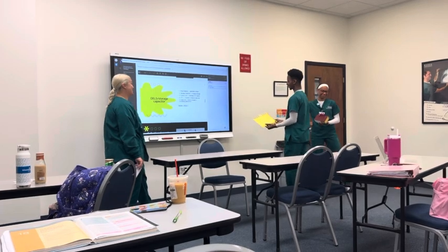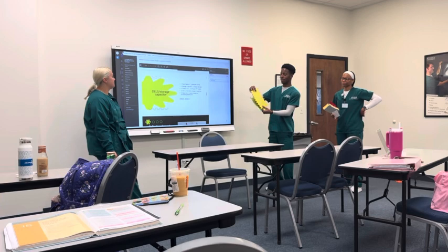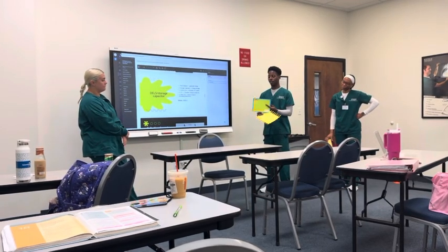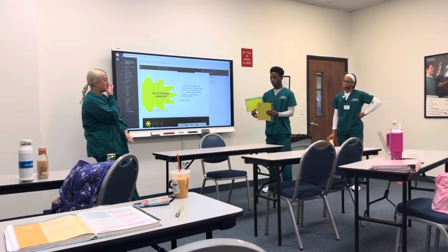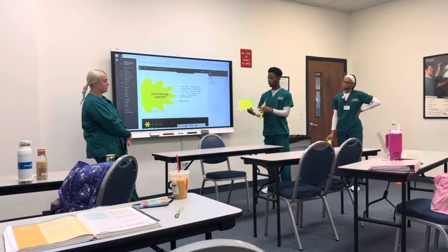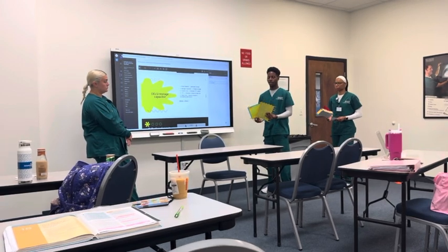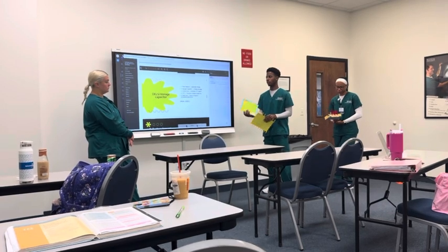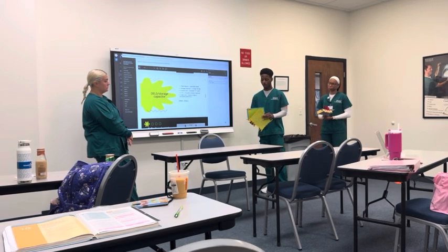This is the matrix array of a thin film transistor in direct digital radiography. This is a pixel element, also known as DEL. Each DEL has a photodetector, a thin film transistor, and a storage capacitor. The storage capacitor is made of amorphous silicon. It stores the electrical charge generated by the detector and releases it once it's triggered by the TFT.